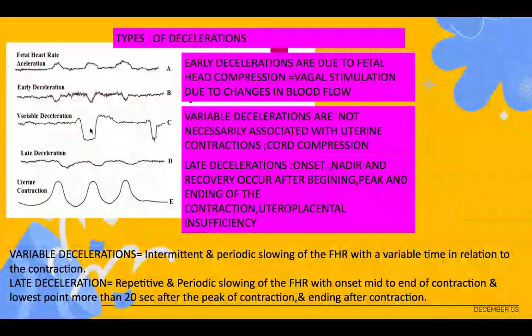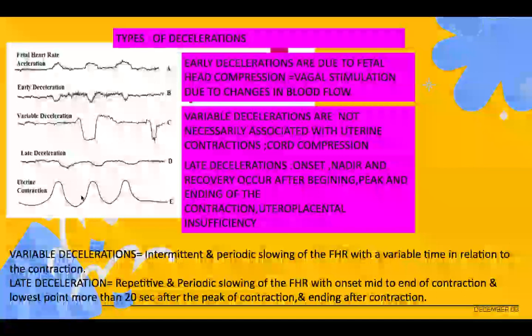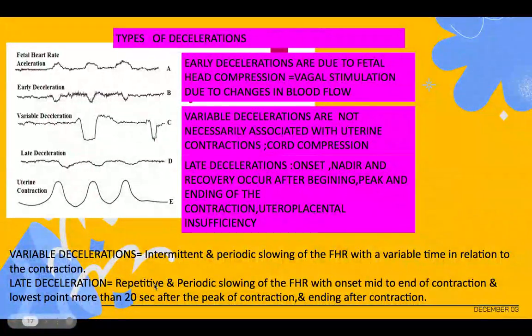This is the variable deceleration. These have no relationship with the contraction. Where the contraction is coming, where the contraction is going, this has nothing to do with that, right? The late deceleration: late decelerations are the repetitive, periodic slowing of the fetal heart rate.